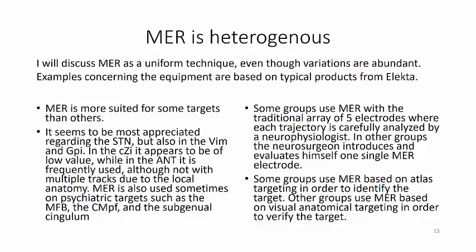Some groups use it with a traditional array of 5 electrodes where each trajectory is carefully analyzed by a neurophysiologist. In other groups, the neurosurgeon introduces and evaluates himself one single electrode.